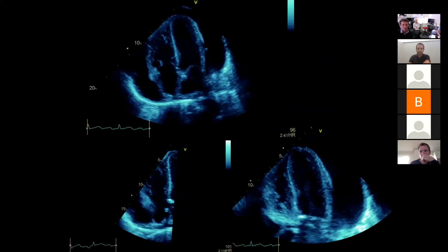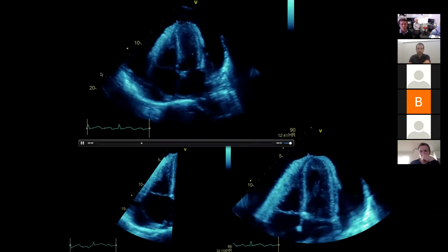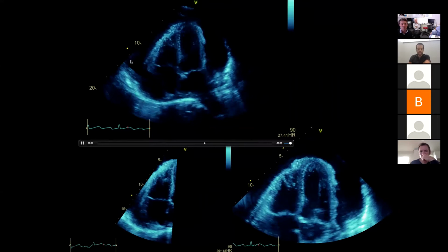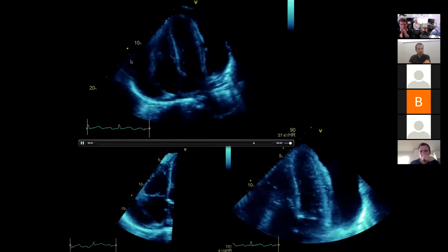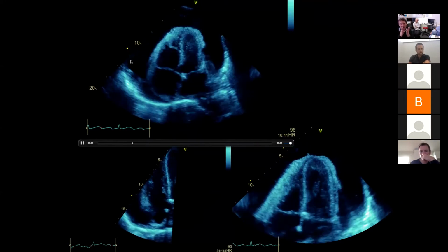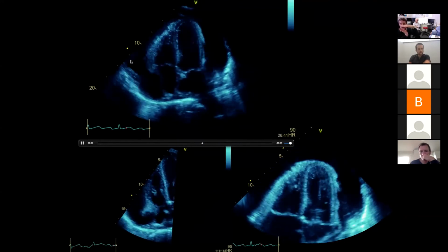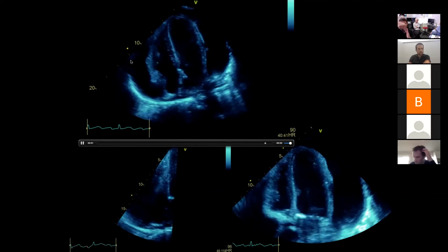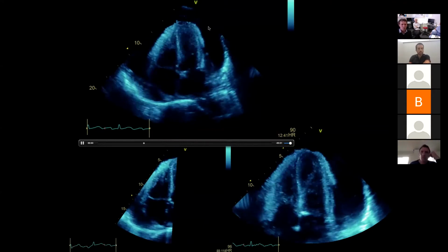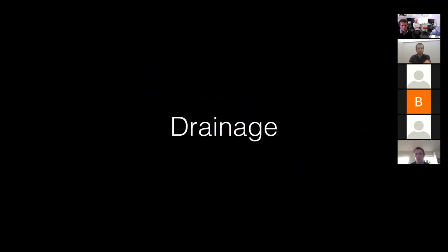But one of the things that I've started to do a lot more is an apical approach. With the apical approach, I go off axis, so I don't use this approach. I actually end up trying to put it down the side of the right ventricle. So as long as I'm at the right angle, off axis, I've got a huge landing zone. If I have a 10 centimeter landing zone, it's only maybe 2 centimeters wide, but instead of aiming for that 2 centimeters wide bit to stick the needle in like that, I have it like that, and I come from an apical approach so that it's 2 centimeters wide, but 10 centimeters long. Does that make sense? So I'm doing a few more apical approaches, but you've got to be really careful. I'll show you an example of this.